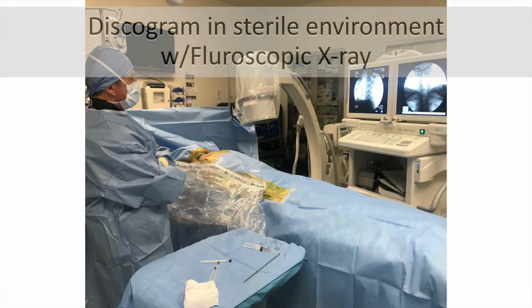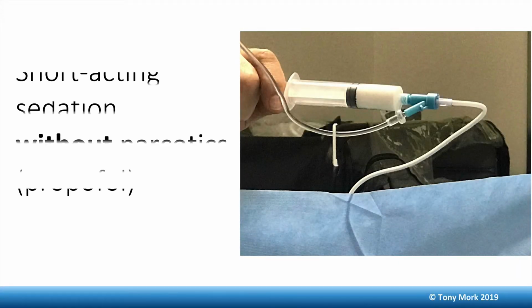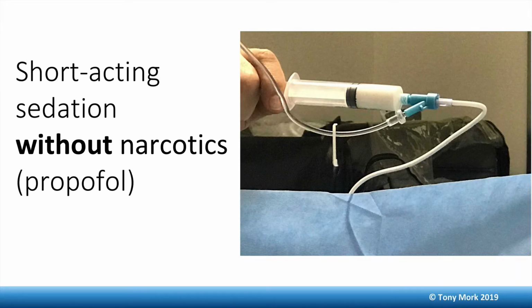And here this is in the operating room. A discogram is performed in a sterile environment in the operating room with fluoroscopic x-ray to place the dye. Before placing that, I don't think things should be painful for evaluating these types of problems. So there's a short-acting sedative without narcotics. Propofol is good because it just puts you to sleep for a few minutes, and it has no narcotics to actually relieve any pain.